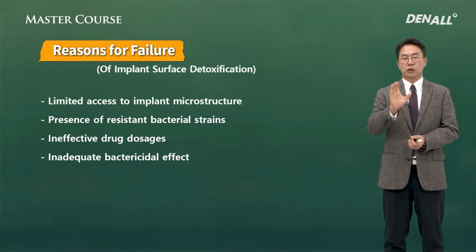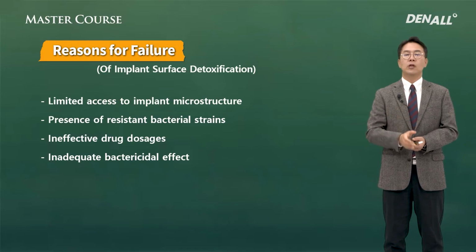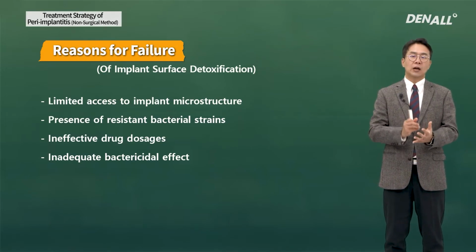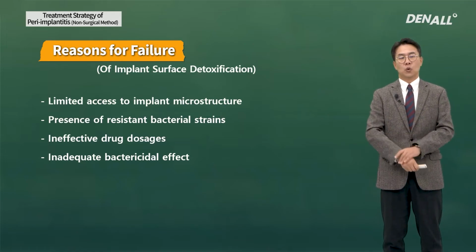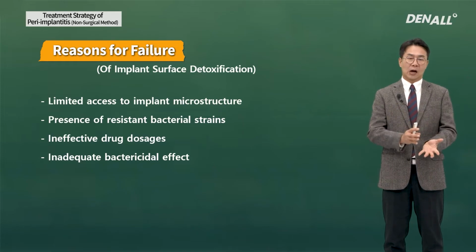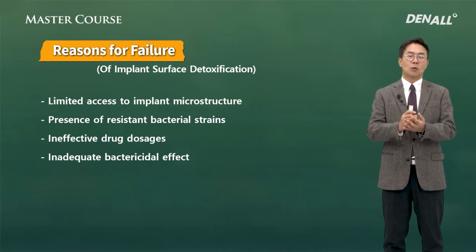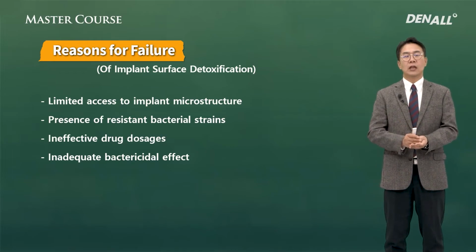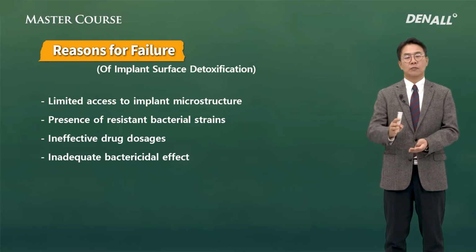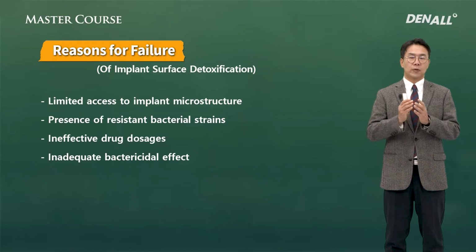Peri-implantitis is in the end toxification or contaminants around the implant body, and you need to reach it directly in order to achieve our desired result. However, we have not opened a flap and the angle in which we access it may be uncomfortable. Therefore, access may be incomplete. Access is very important. Because we're not able to access it properly, it is not removed thoroughly.